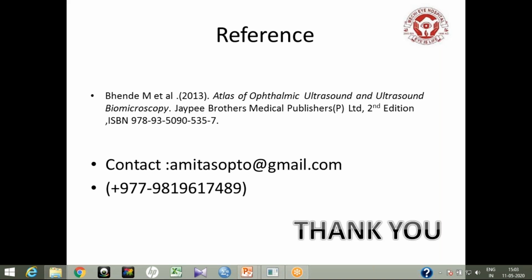What I feel, as Amit said, the velocity of sound in silicon oil is right. It's 932 around, I think. If it is 1532 in phakic lens, it's 932 in silicon oil. But I'm disagreeing with another point of Amit. What I feel, the silicon oil refractive index is more than vitreous. I think it's around 1.40. But why is it hyperopic?